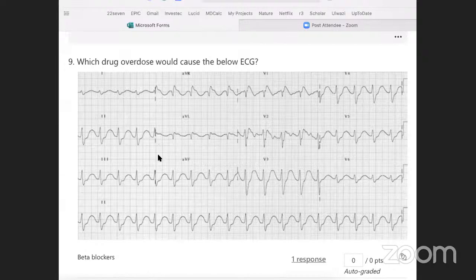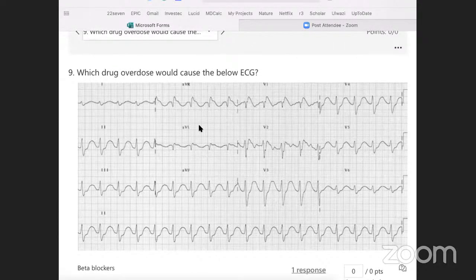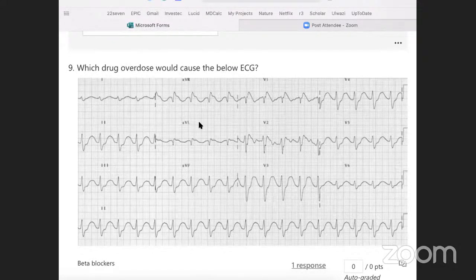So I don't really have an idea of what's cracking with my ECG, so I follow my normal approach, and then I can see what's abnormal is that I have this widened QRS with AV dissociation, and I have these very pronounced ST T wave segments, and I have an extreme axis deviation. And so I would then Google from a reputable source, and I would see a differential for what causes extreme axis deviation and ST segment elevation in AVR. And at the top of my list, tricyclics would definitely come up.